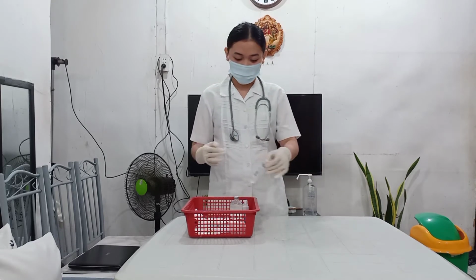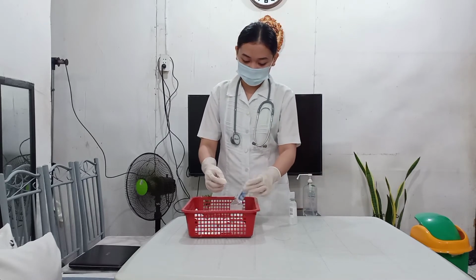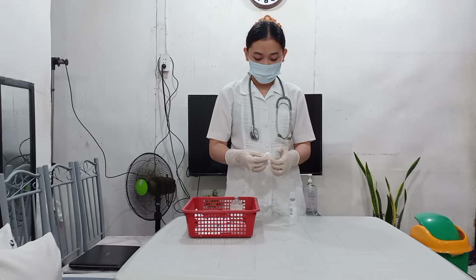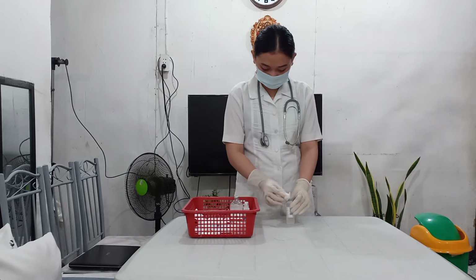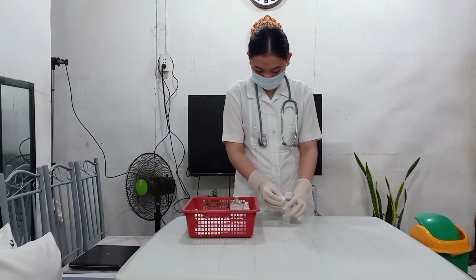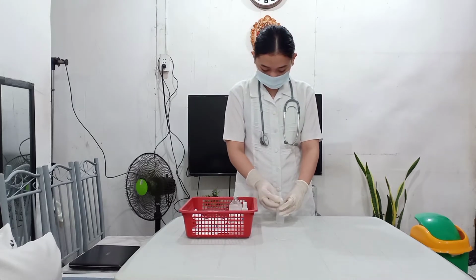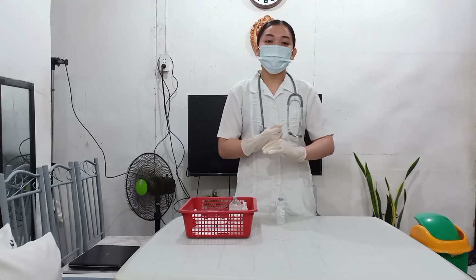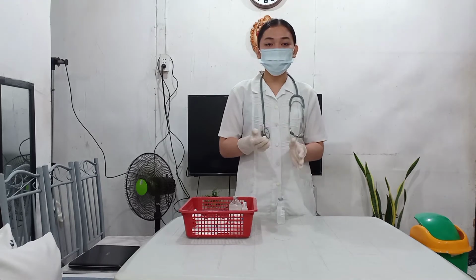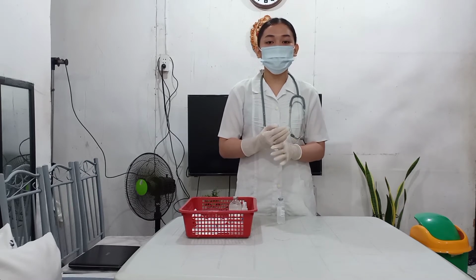So, we prepare here the ampule. I am going to clean and disinfect the ampule using the cotton swab and the alcohol. I am going to clean the neck of the ampule. After which, I will flick the upper stem of the ampule several times with my fingernail. This facilitates movement of medication in the stem to the body of the ampule.